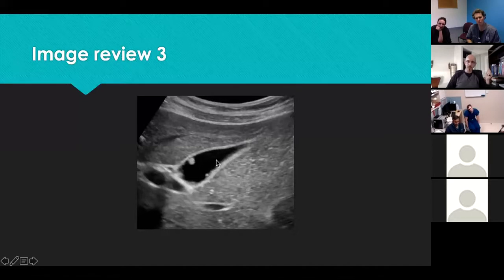Yeah. Look, if you look at this part of the gallbladder wall, it would definitely fall within the normal range. This looks a bit thicker, okay? If you imagine this is a curved probe and the beam is coming from there, hitting that part almost perpendicularly, but when it reaches there, it's almost 45 degrees.